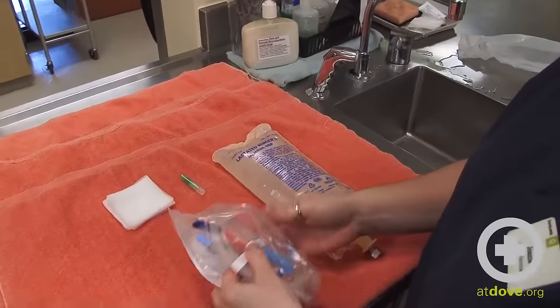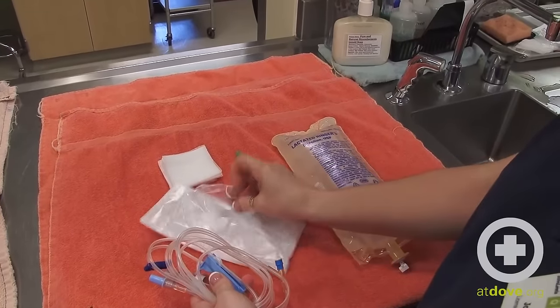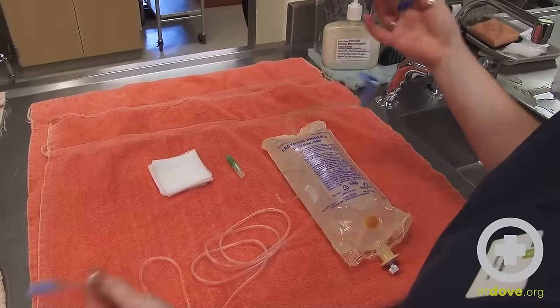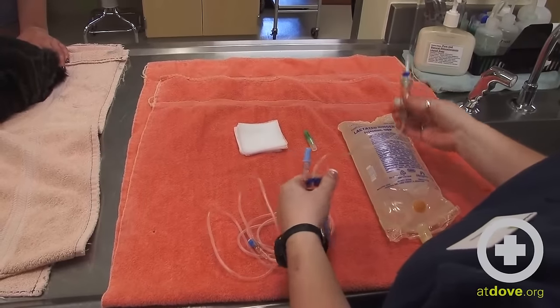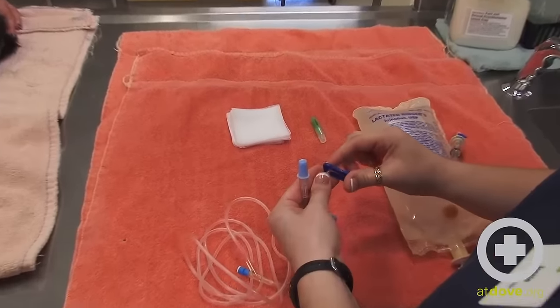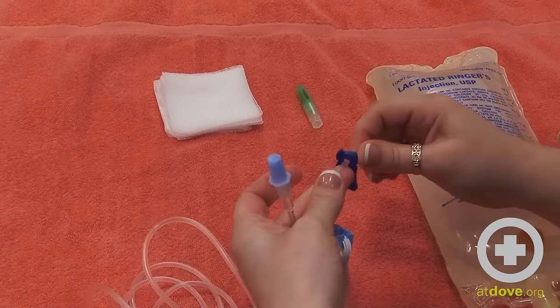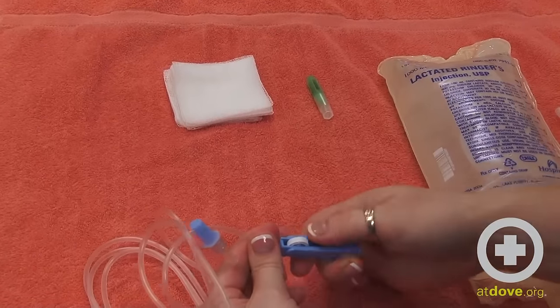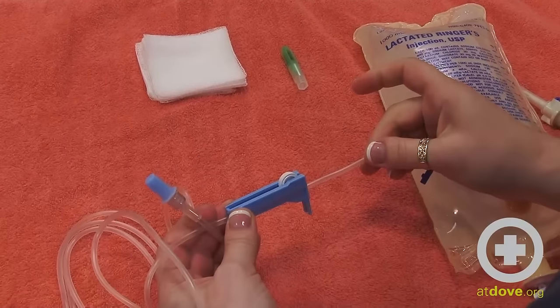For the drip set, I'm going to open up the bag and untangle the line. On our drip set there are multiple types of clamps. There is this dark blue sliding clamp — here it is in the closed position, and here it is in the open position — and there is a roller clamp which you roll with your thumb; that is in the closed position and that is the open position.